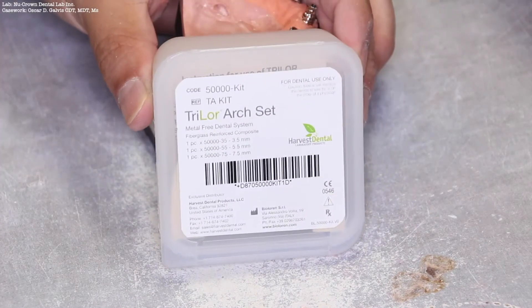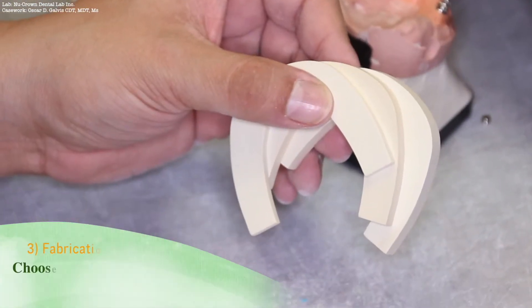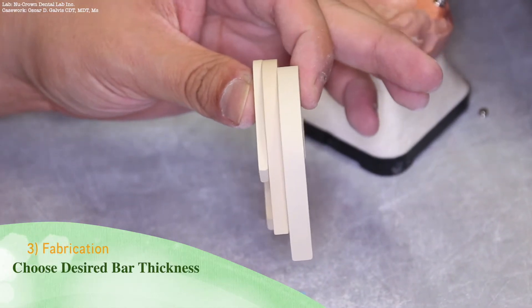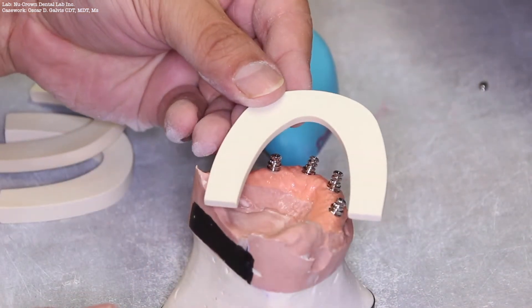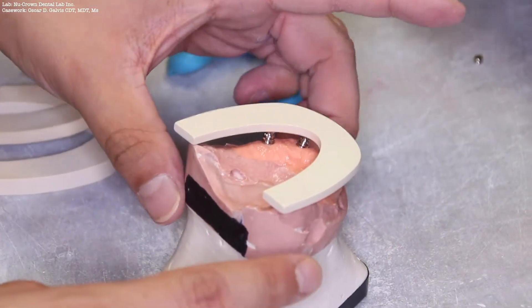We are now ready to open up the Trilor Arch Set. Within this arch set, there are three different thicknesses for different types of substructures. Choose the desired thickness for the substructure. The substructure thickness desired here is 3.5 millimeters.